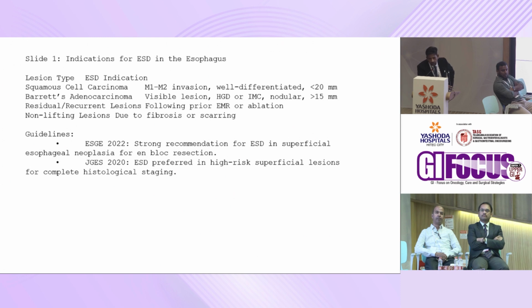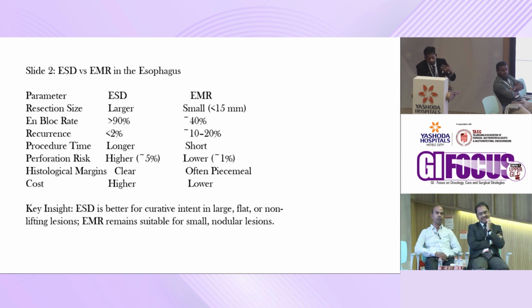Then you have to move from EMR to ESD, because of the lifting up, as I told you, when you want to lift your tiles up, you want to make sure that there's enough surface beneath it. So that's what it is. So you need to find out who has done it, where it was done, how it was done, how large the lesion is, and what modalities you have.